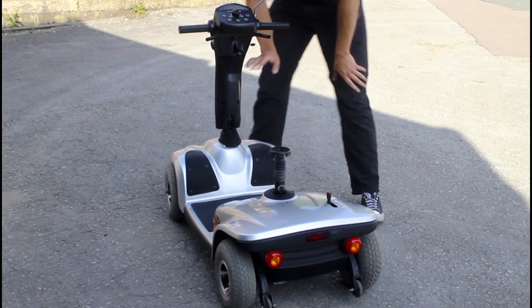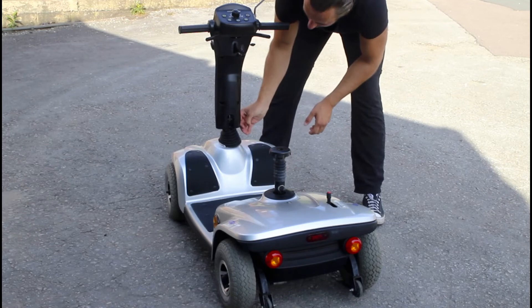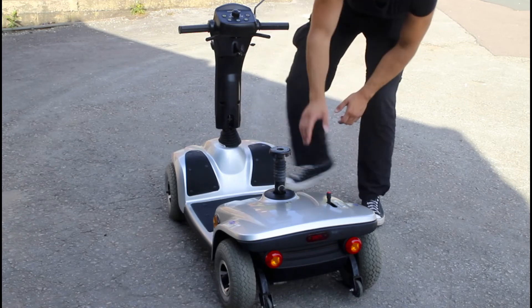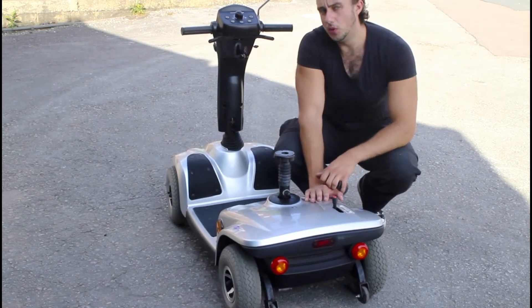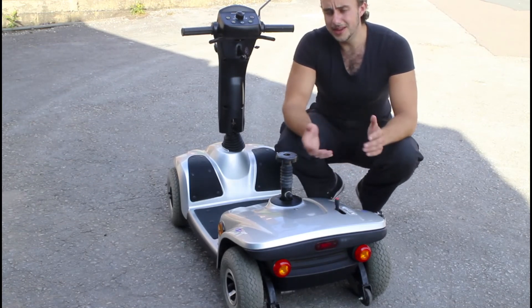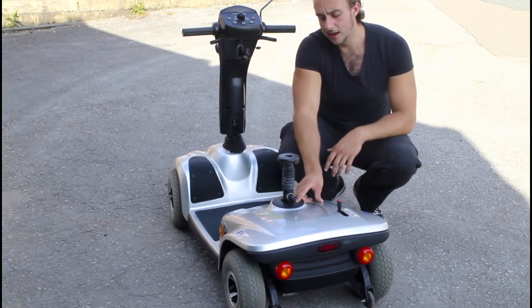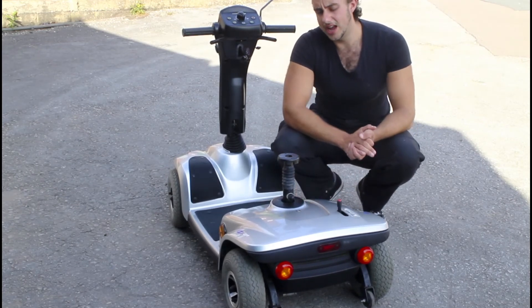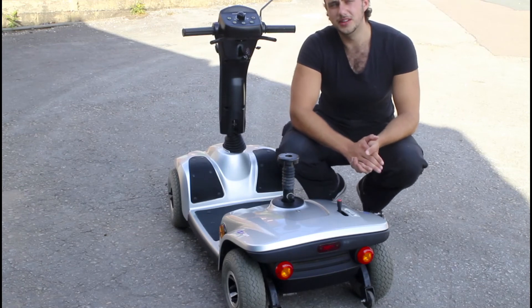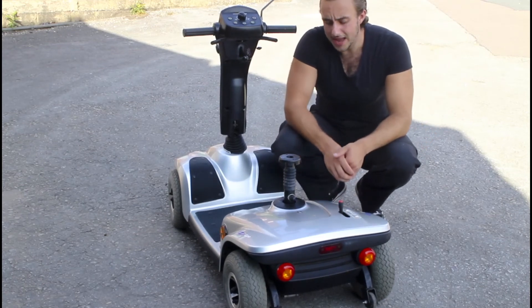So to summarize: this model and the Rascals use the lever underneath, the Prides use the lever on the side, and the folders will usually have a lever at the front. If there are any other models you're wondering about, feel free to message me in the comments or on live chat — one of the team will be able to help you. We won't charge anything just to help you out.